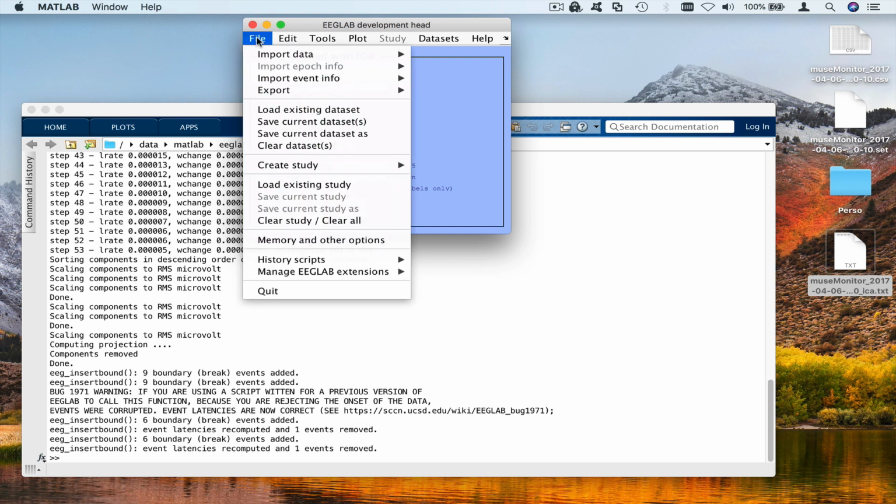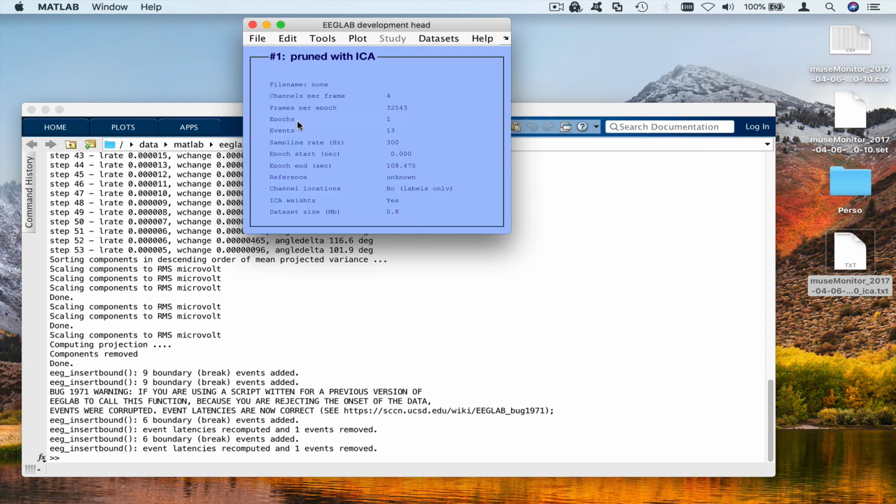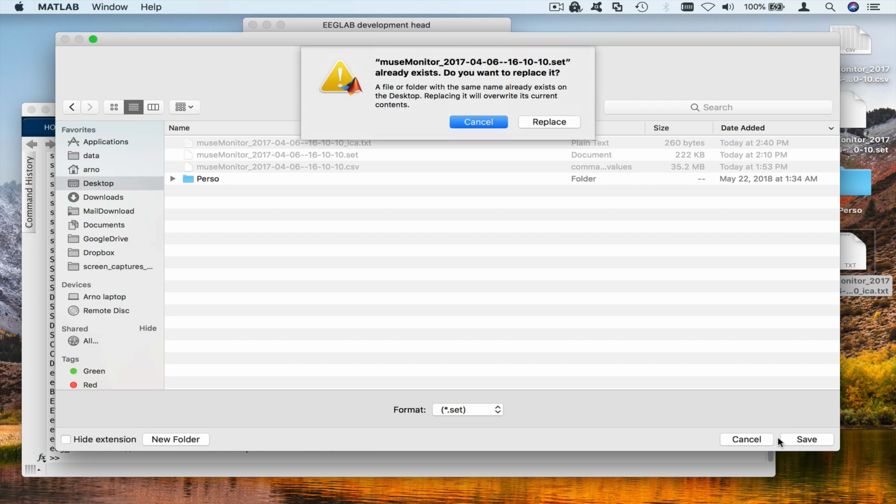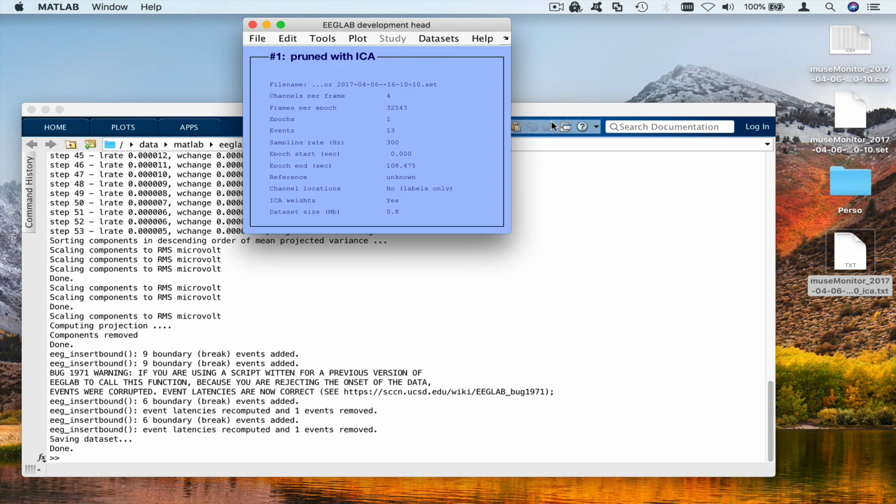So once you're done, you're going to save your dataset, set as on the desktop with the same name as you imported it. So here I already have it .set, so I have to replace it. And so sometimes you won't find an ICA component that's removing most of the noise. If it doesn't look like it, just don't remove anything. Just remove some data channels.